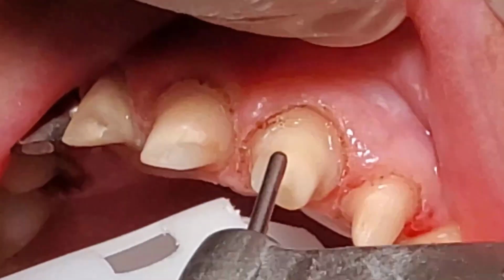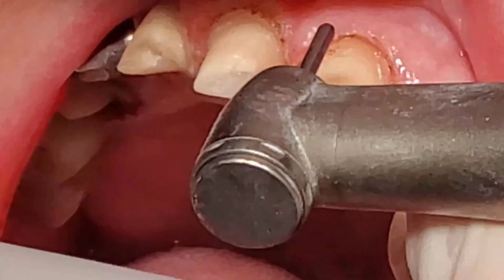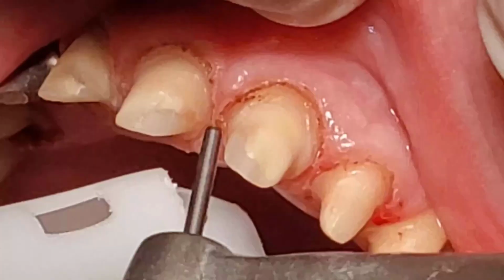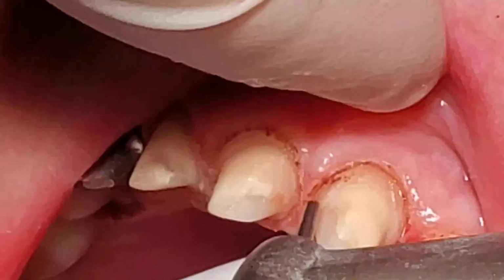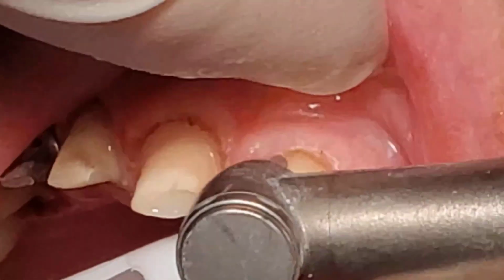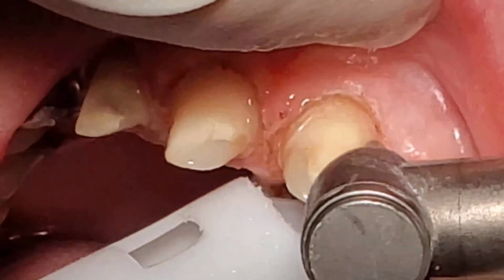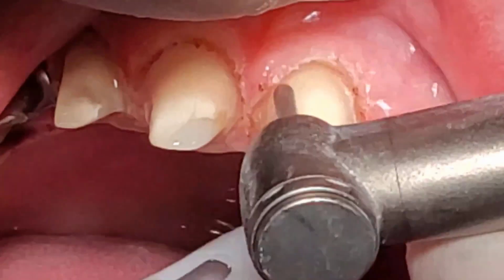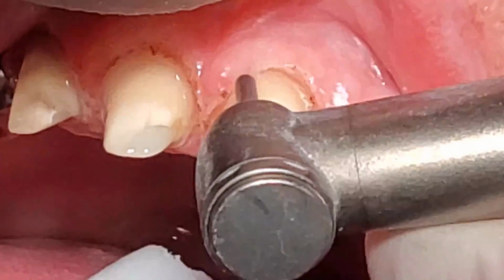We've pretty much completed our preparation. We've taken our NSK NLZ electric handpiece and dialed it down to about 18,000 RPMs. And we're going to refine the margin using this burr from Microcopy that has some diamonds at the end. And you get complete tactile sensation. This is how we prepare our crowns to get ideal finish lines in order to get a perfect impression. There's nothing being removed off the axial wall, but just off the end.